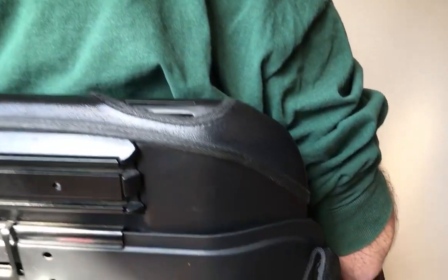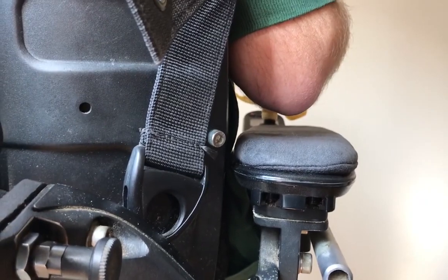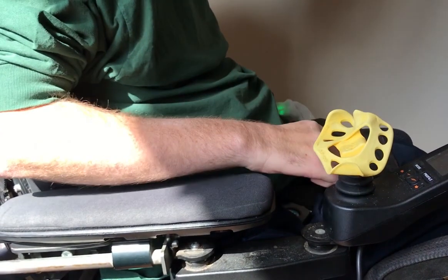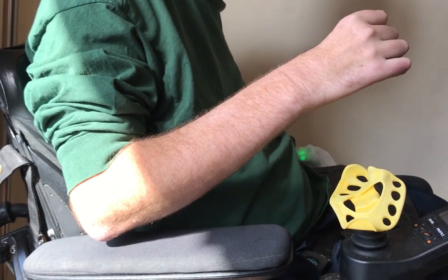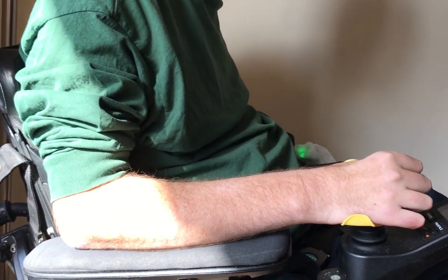For best comfort, adjust the armrest so that when your arm is relaxed, your elbow is directly over it and a palm width above. The top face of your controller should be even with the top of the armrest pad. The joystick should be positioned such that your hand sits directly on the handle when your elbow relaxes.